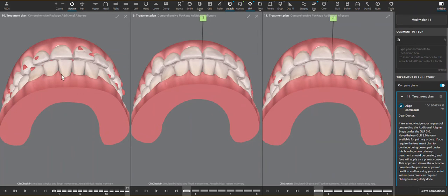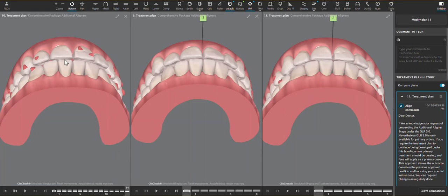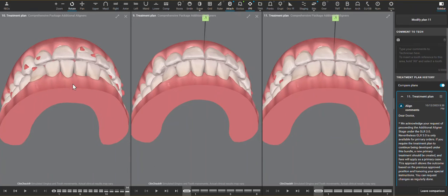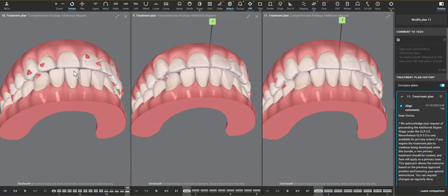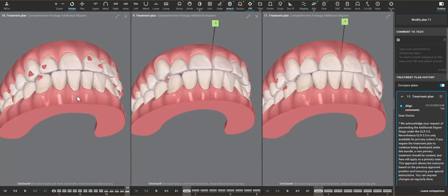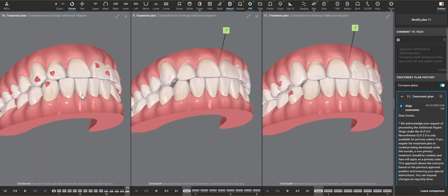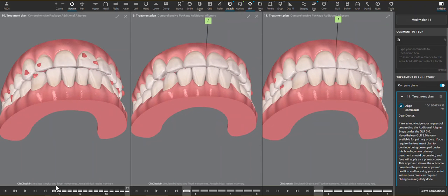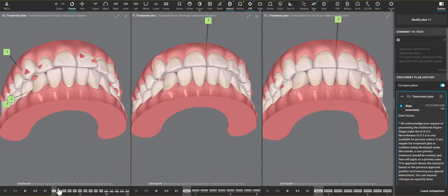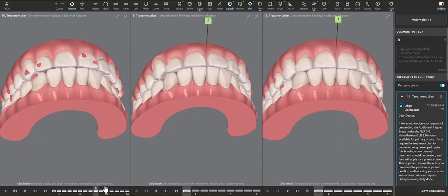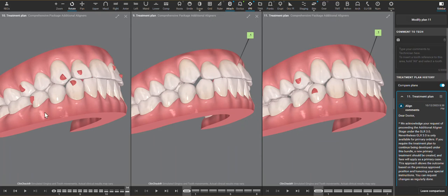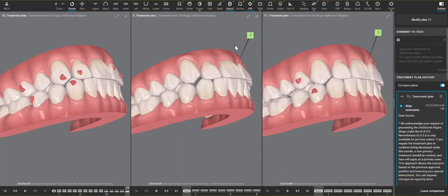That would have been really helpful to finish out and really make these lower anterior movements more predictable, as well as relieve the anterior interferences. I think bite ramps still would have been beneficial to prevent the molars from passively intruding. This ClinCheck looks good in the anterior but ultimately I don't think was going to be all that effective.